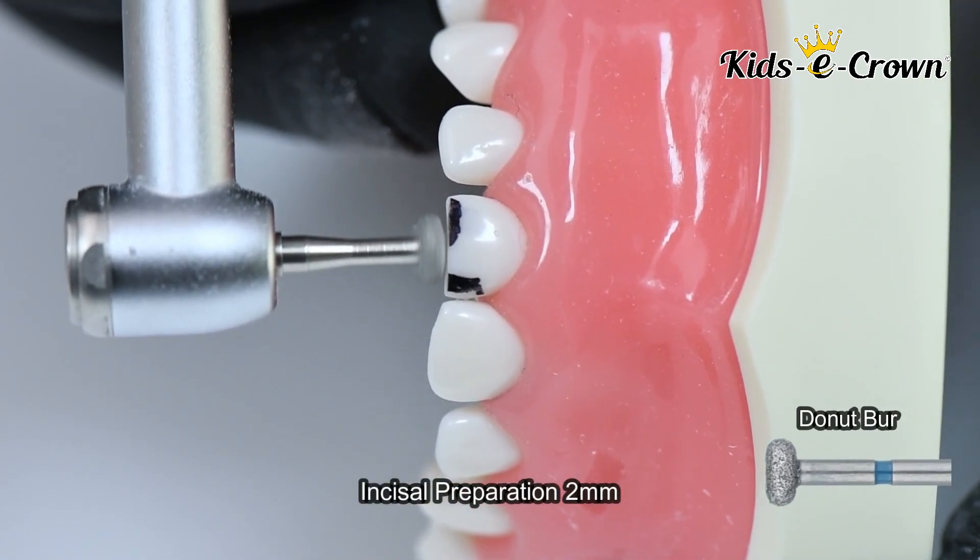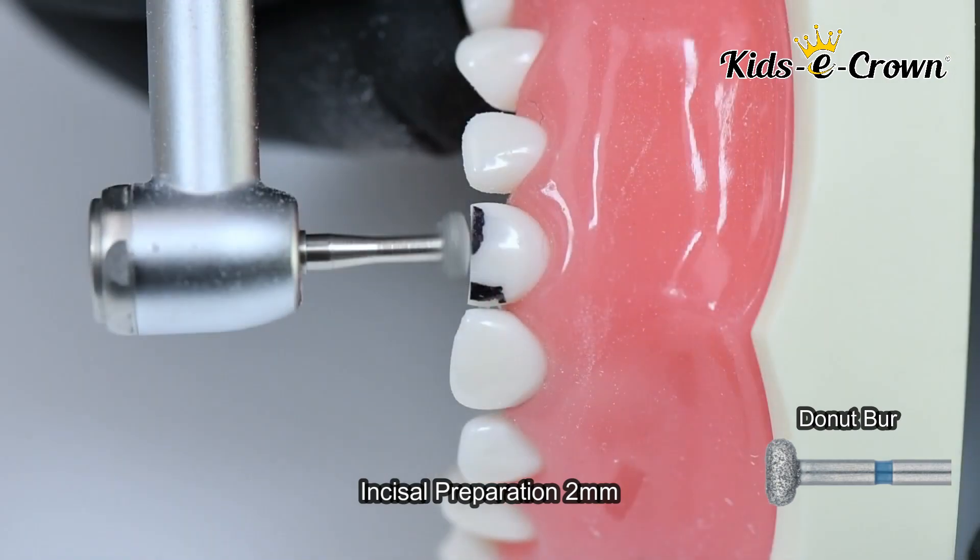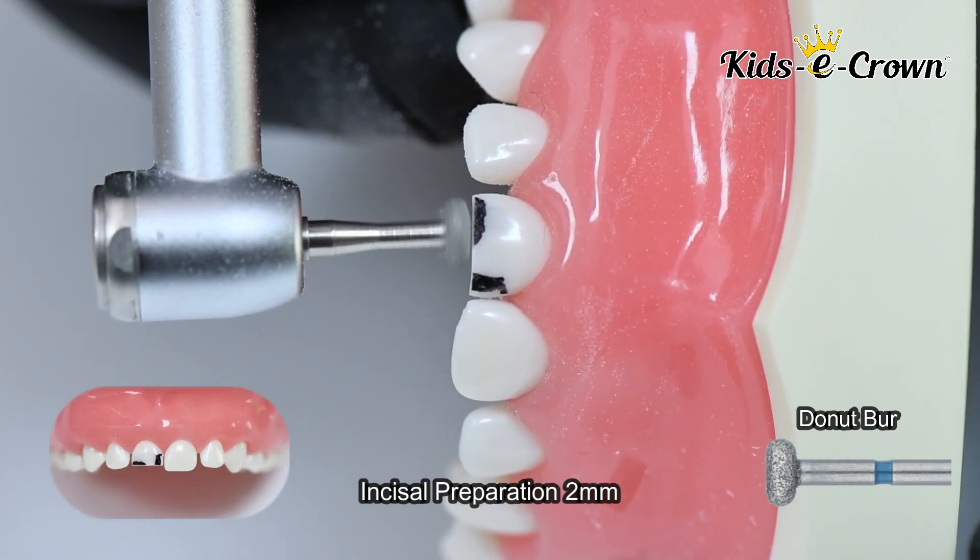The first step in the preparation is incisal reduction of 2 mm using a wheel or donut-shaped burr.